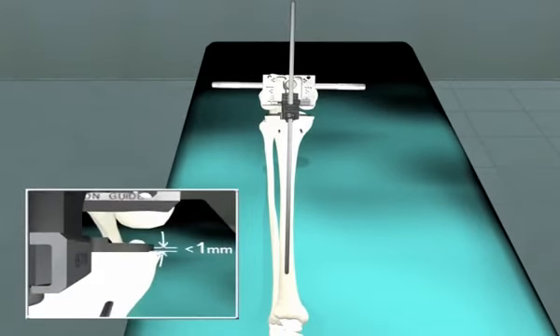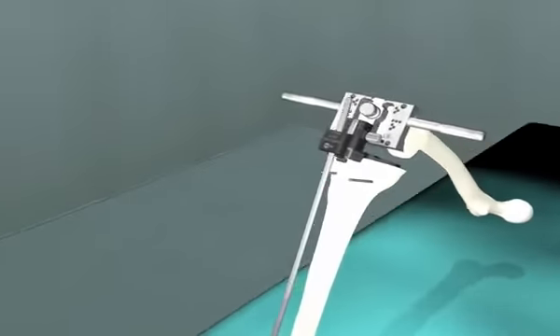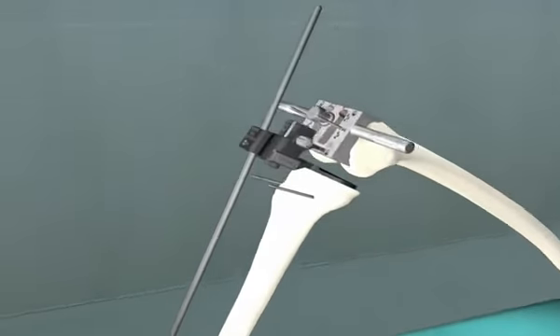The alignment rod can be used to assess the amount of tension in either compartment. This alignment rod also can be brought down to the tibia to check for proper tibial resection angle. The guide is then pinned into place, giving equal compartment tension medially and laterally.